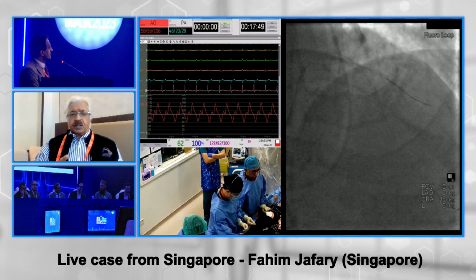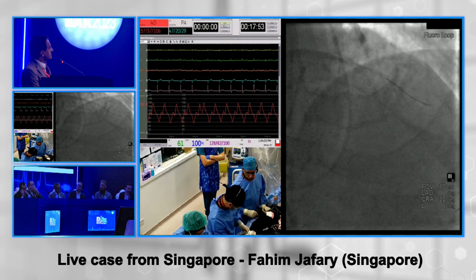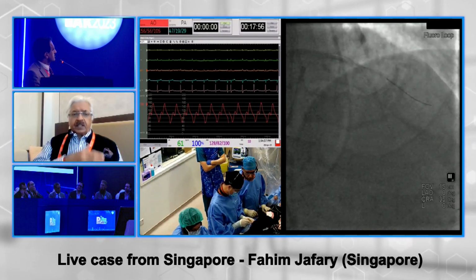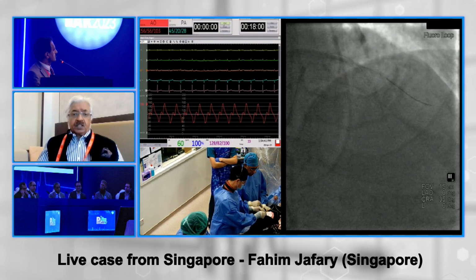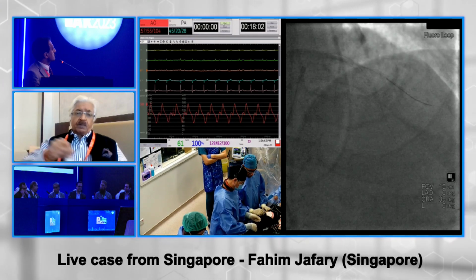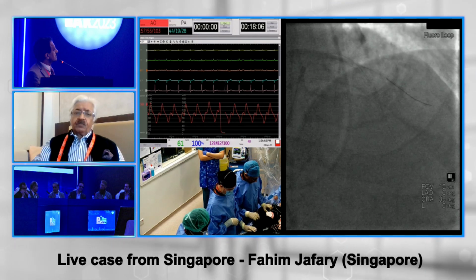After a point, you chase MSAs, and that is why when we go ultra high pressure on an OPN, we must look at MSAs prior to using our OPN. We may have adequate expansion, and there may not be any reason to use an OPN because we may be chasing an eccentricity which is unnecessary.